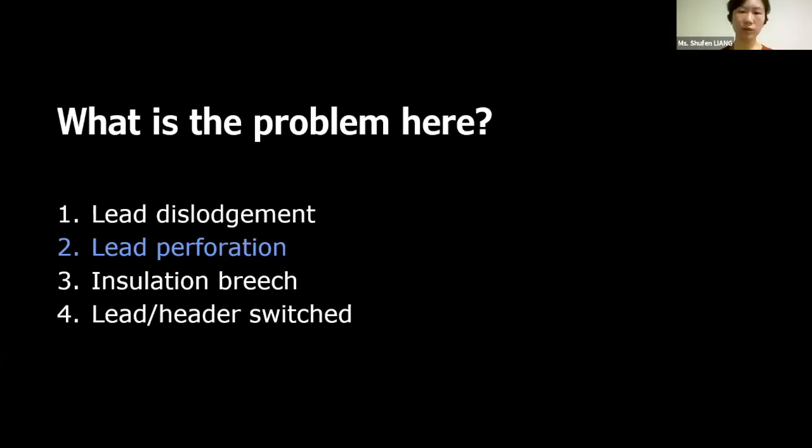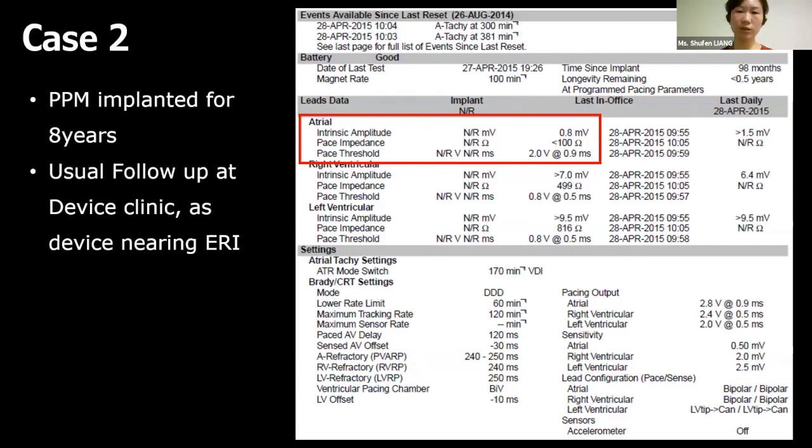Okay, we go on to the next patient. For this patient, the device has been implanted for 8 years, and the patient comes in for a usual follow-up in the device clinic. And I've highlighted for you what you should be looking at.